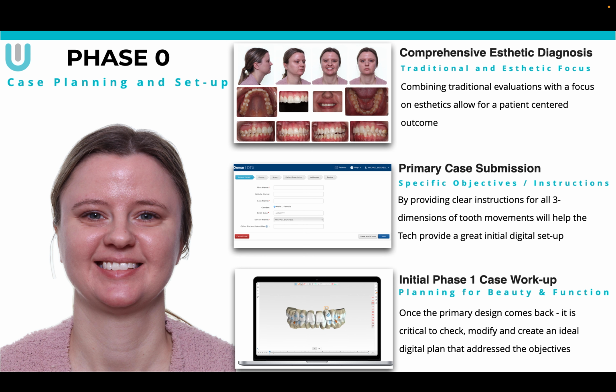Again, we do the same thing. We break our aligner cases up into 3 phases so that we can have some structure in our clinics. So whether it's braces or aligners, we go through 3 rounds so that we can really compartmentalize the objectives and the goals. So when we're looking at these rounds, the first thing starts with how we think, diagnose, how we plan, and how we treat.